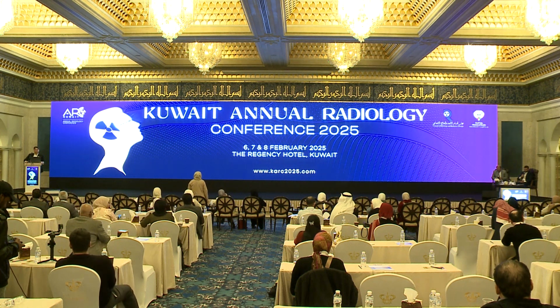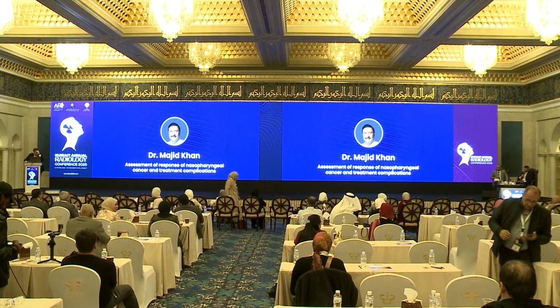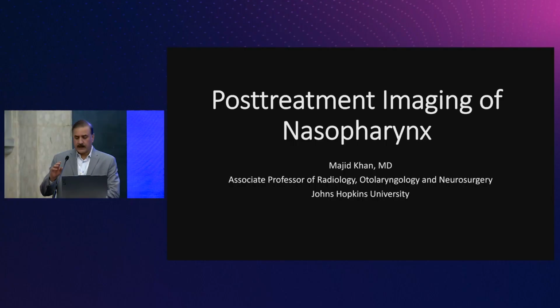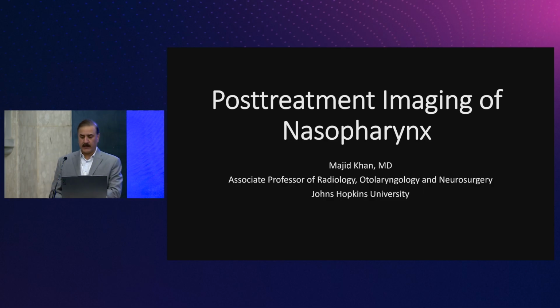Now again with Dr. Majid, we will have a presentation about assessment of response of nasopharyngeal cancer and treatment complications. Okay, so earlier we talked about the nasopharynx tumor. Now we are going to talk about the post-treatment neck imaging after the nasopharynx has been treated.